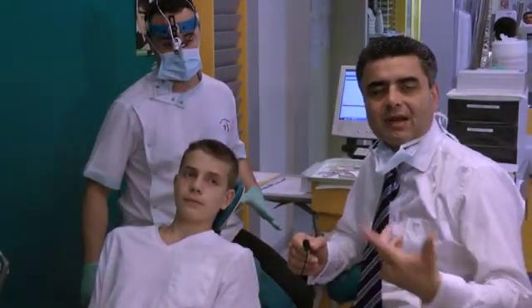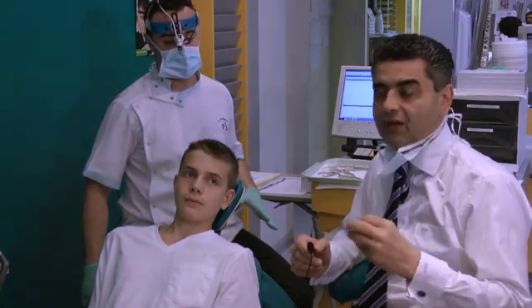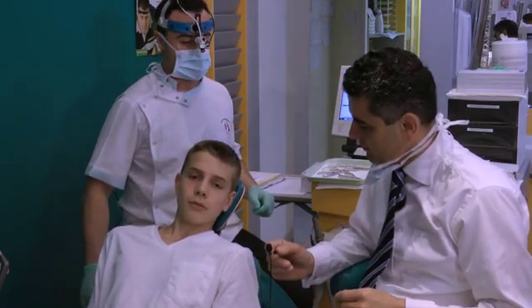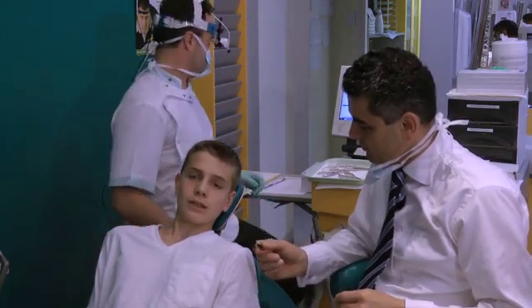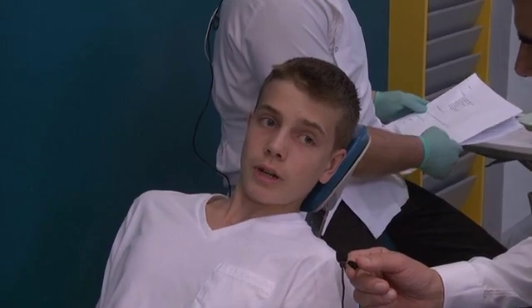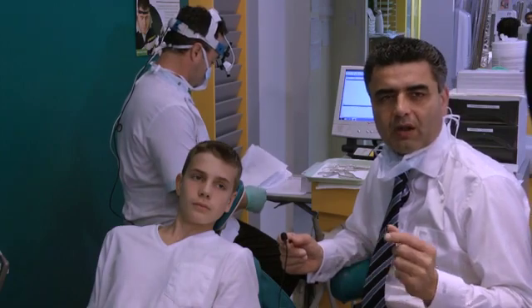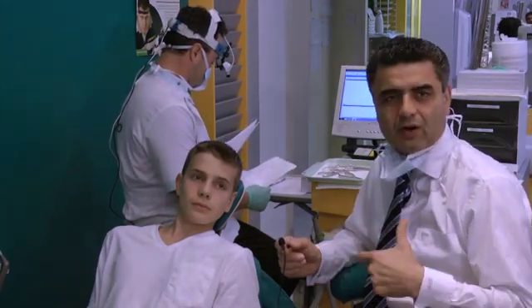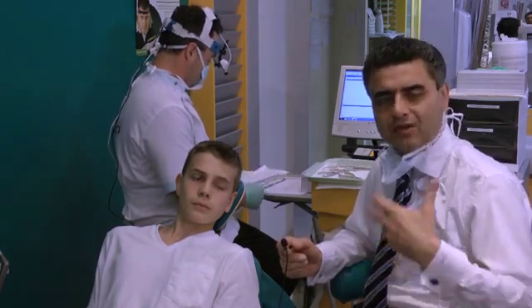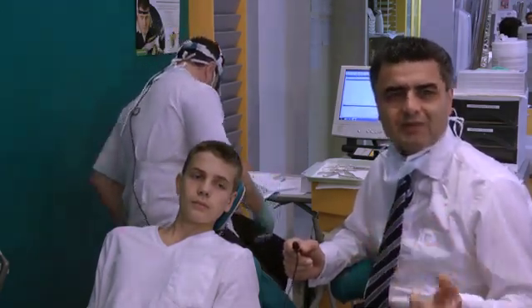We might ask Oliver, as the patient, what his experience has been with the bionator and the 2x4 mechanics. Oliver says it's easy to wear, stays in at night, and is pretty comfortable. He wears it every night most of the time. Ideally at end of phase one, I'd like the patient to put the appliance in as soon as they get home from school, take it out when eating, brush their teeth, and then put it back in until the following morning — about 12 hours a day — which really helps retain the changes from phase one.